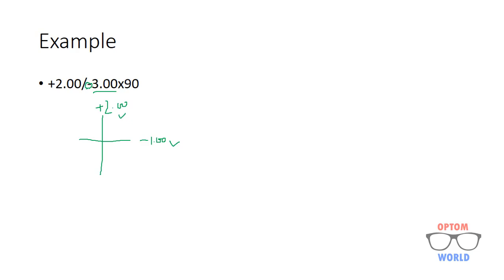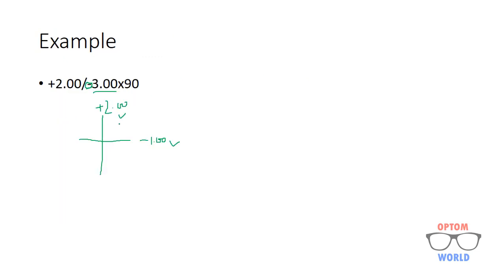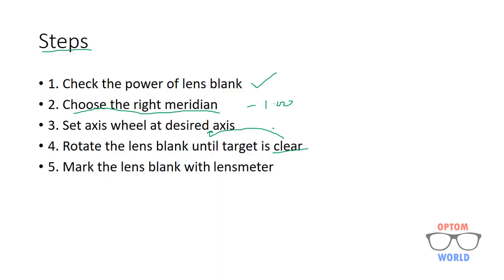In this prescription the cylinder is in minus, so as the rule indicates, I will choose the more minus or less plus meridian, which here is minus one. I will move the power wheel of the lensometer to minus one, then set the axis wheel to the desired axis, which in this example is 90 degrees. I will then rotate the lens blank until the target is clear. When the target is clear, it means I am at the axis of 90 degrees as required in the prescription, and then I will take the lens marking.